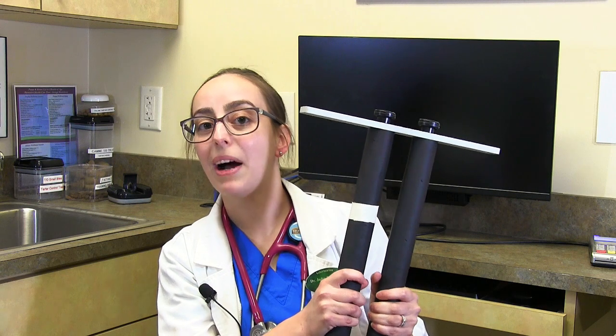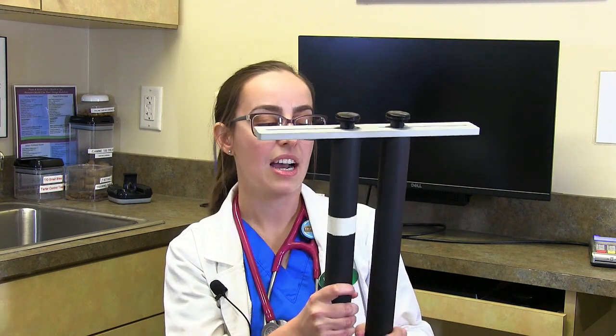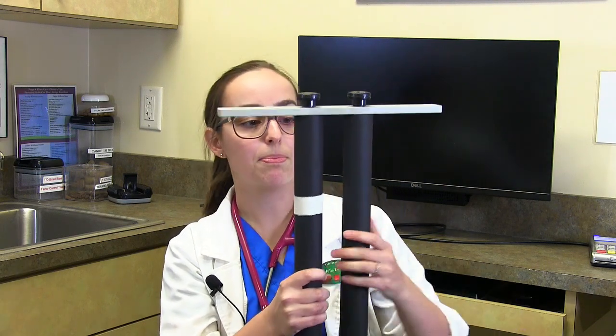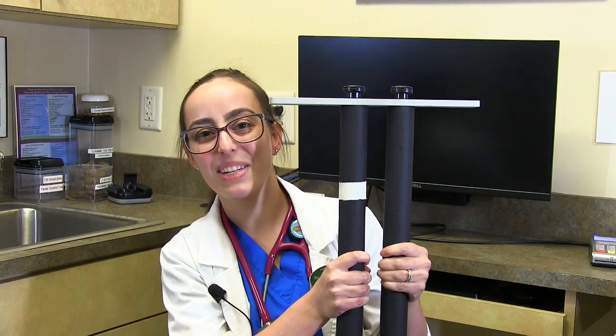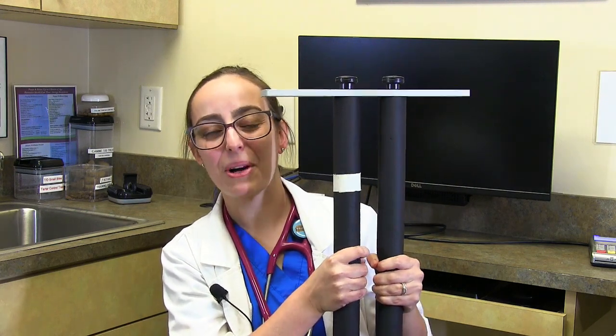This is what we call a distractor — a specific tool designed by the University of Pennsylvania specifically for this test. This distractor goes the width of the dog's pelvis. The last dog I did was a very small dog because its pelvis is narrow.